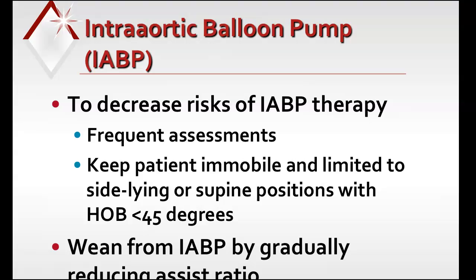The patient may also be receiving ventilatory support, and will likely have multiple invasive lines. All of this is going to increase the challenge of comfortable positioning as well as the risk for skin impairment. So the patient may experience sleeplessness and even anxiety. So sometimes you will provide sedation. We want to make sure that we provide adequate pain relief, skin care, and employ those comfort measures as often as we can.